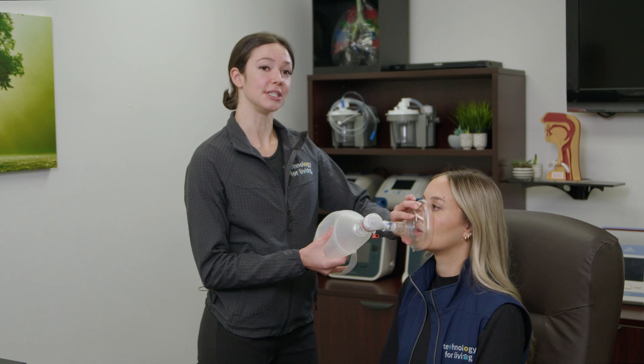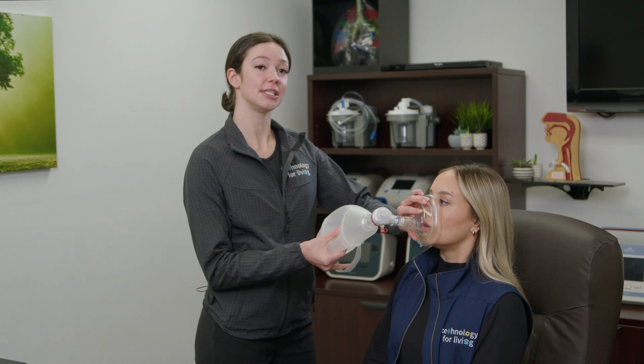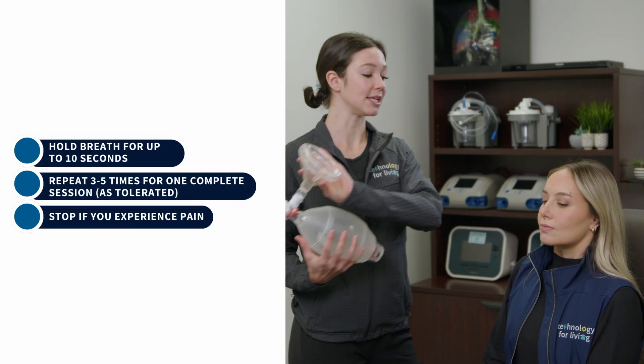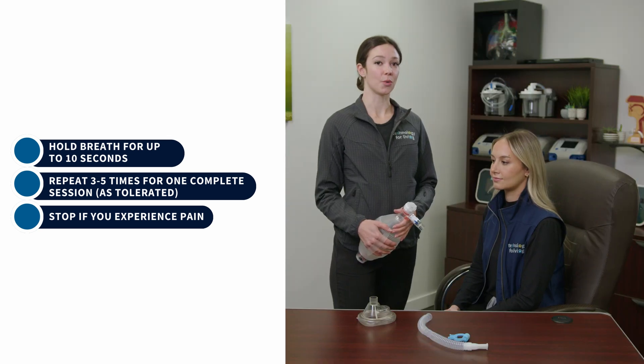Squeeze the bag slowly for a deep breath. Hold your breath and stack another breath on top of the first. Continue to stack breaths, pausing briefly between each one, until the lungs are completely full. Hold the breath for up to 10 seconds, then remove the mask and exhale.